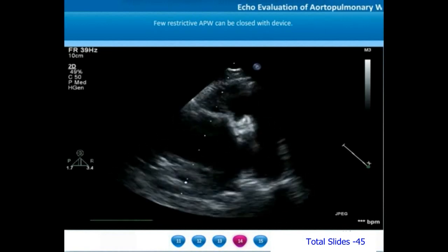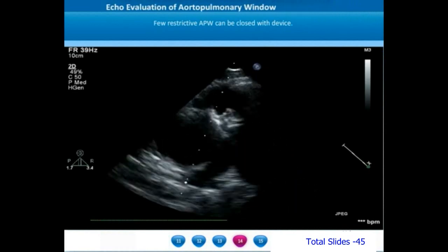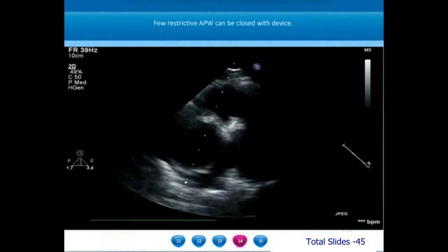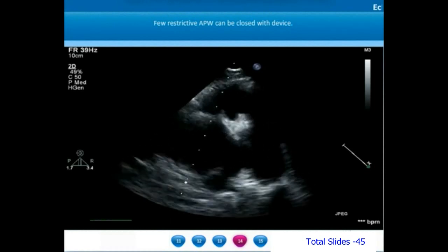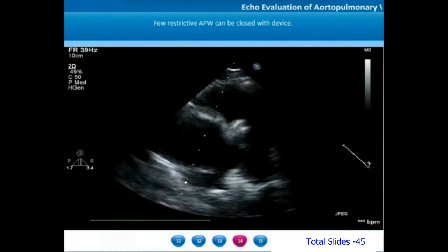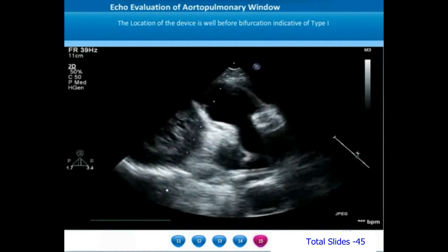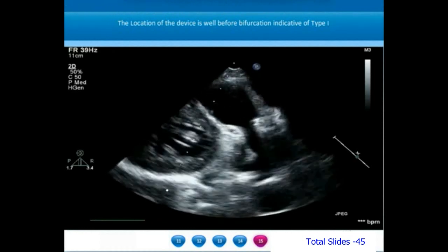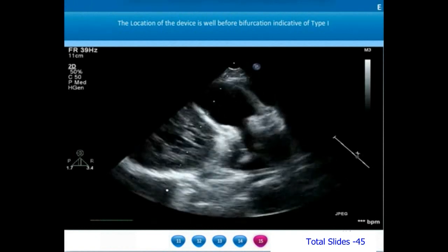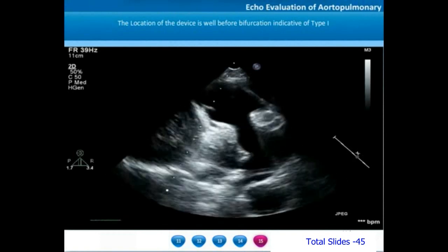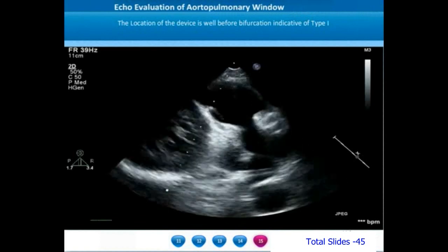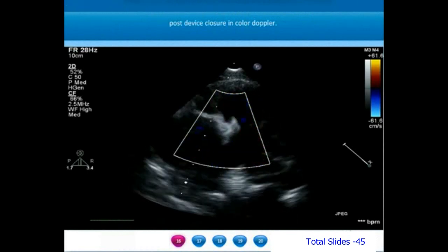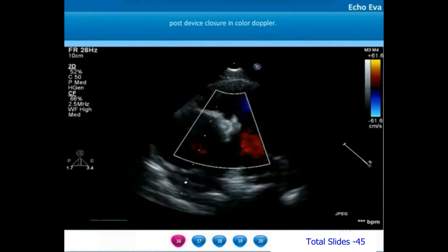When an aortopulmonary window is very restrictive, it may be amenable for transcatheter closure. In this example, the proximal aortopulmonary window was quite restrictive in size, permitting closure with an occluder device. On a long axis view from a parasternal window, with a leftward sweep to identify the pulmonary valve and main pulmonary artery, we appreciate the device sitting in the proximal main pulmonary artery. On parasternal short axis view, there is no residual flow after device closure of this proximal AP window.